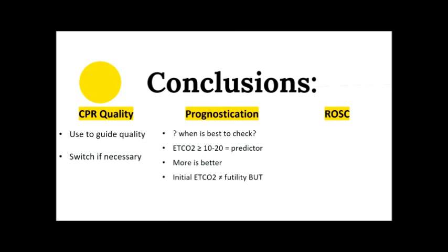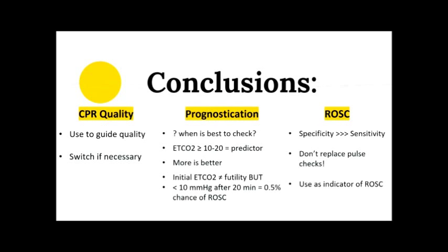Our initial end-tidal does not predict futility, but if you've had ongoing CPR for 20 minutes and they have a value less than 10, then that patient has a 0.5% chance of achieving ROSC. Now, with ROSC itself, it's highly specific, not sensitive. Therefore, do not replace your pulse checks by just looking at the end-tidal CO2. But if you notice an abrupt and sustained rise, then you likely have achieved ROSC in that patient. Overall, thumbs up. This should be part of our standard practice. I'm glad to see that nearly everybody put up their hand.